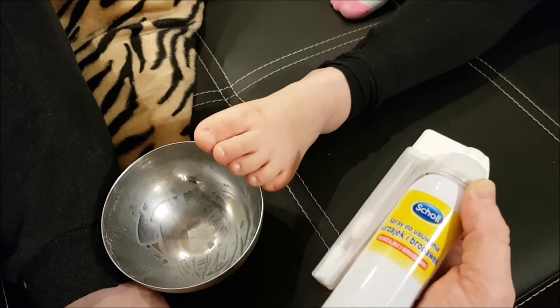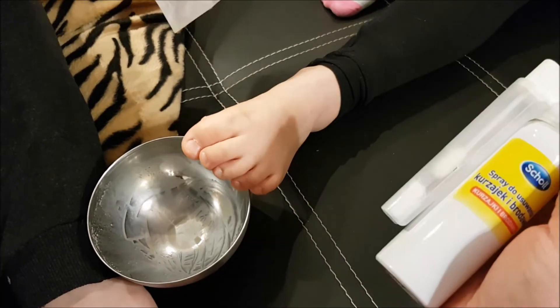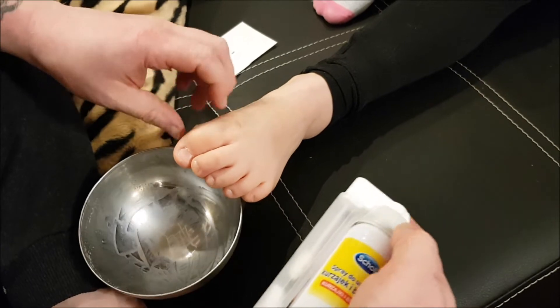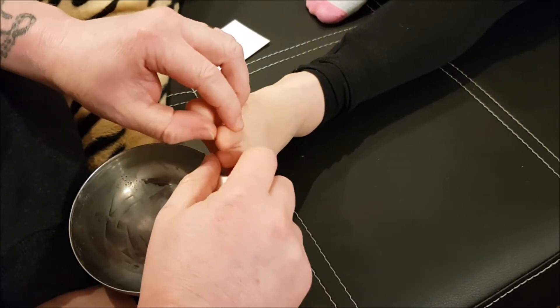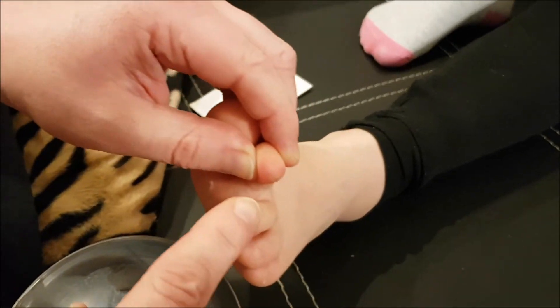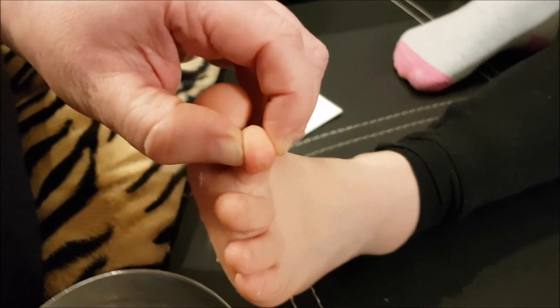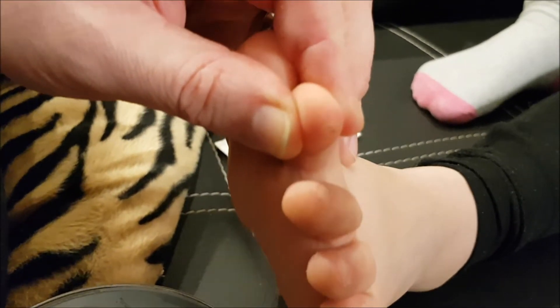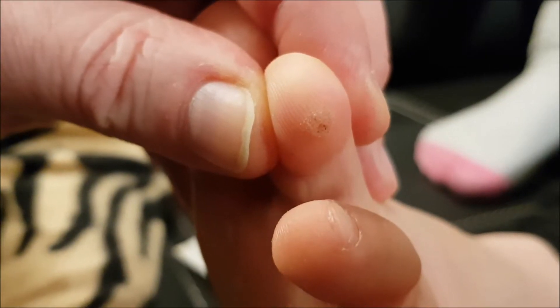What we're going to do today is use this compound to freeze off the wart from this youngster's foot. You can see here, let me show it to you up close — yeah, that's it.